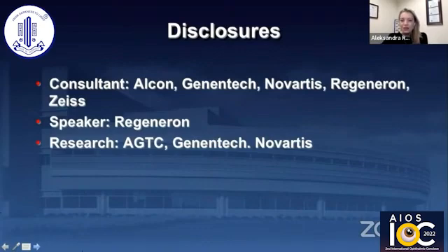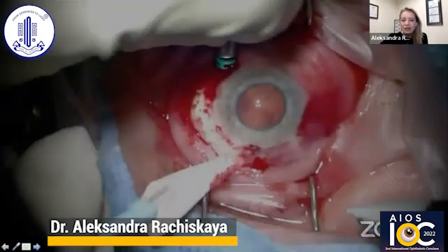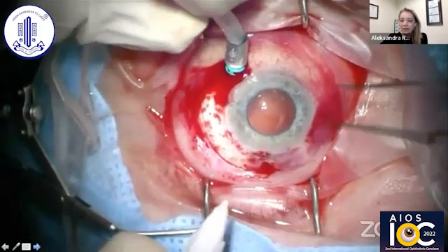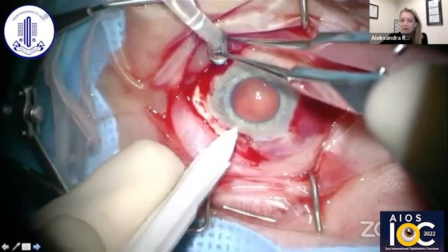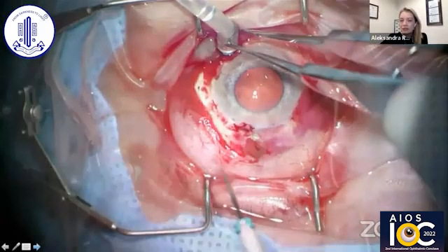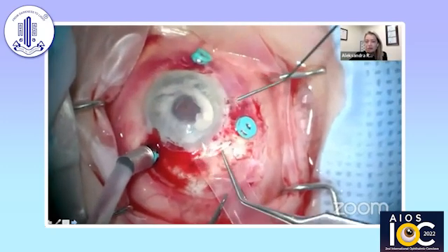These are my disclosures, which are not pertinent to this presentation. Pearl number one: you really need to know what's inside that eye, because as retina specialists, we're often taking things out that we didn't put in. In this case, we discovered that the patient had a superior tunnel, and as we were performing the surgery, we realized that if there's a tunnel, it's probably a PMMA lens. We weren't able to get records, and we needed to avoid that tunnel while still placing our sclerotomies for the vitrectomy — we ended up doing a temporal tunnel as opposed to the superior tunnel, which is my usual approach.